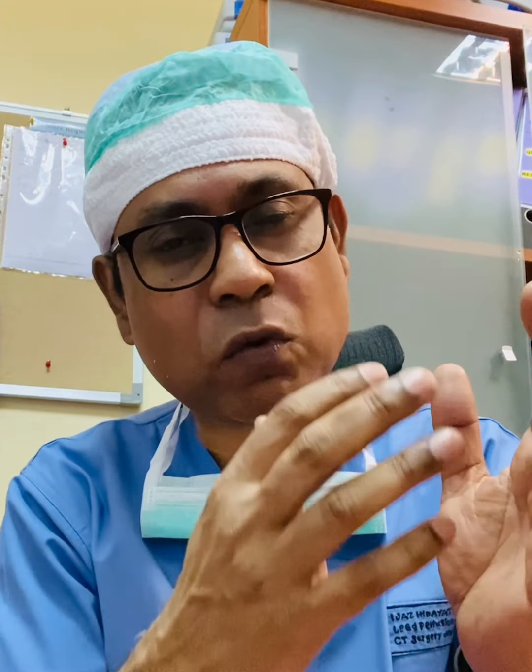What does ECMO stand for? ECMO stands for extracorporeal membrane oxygenation. Extracorporeal means outside the body. Membrane is the artificial lung where we oxygenate the blood, the process of providing oxygen to the cells and delivering it to the patient's body.